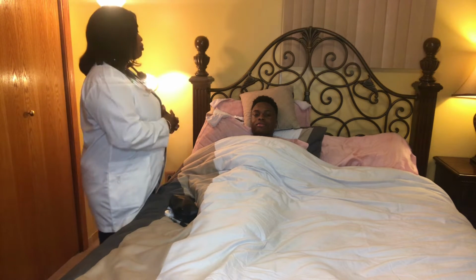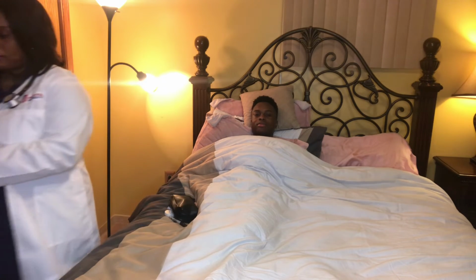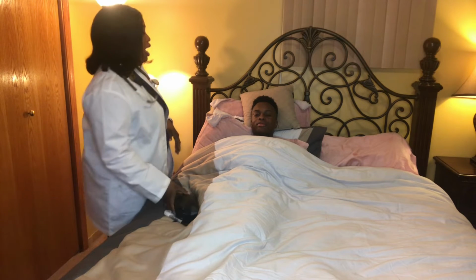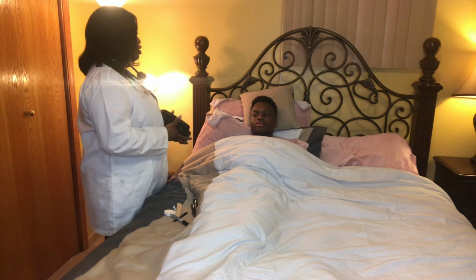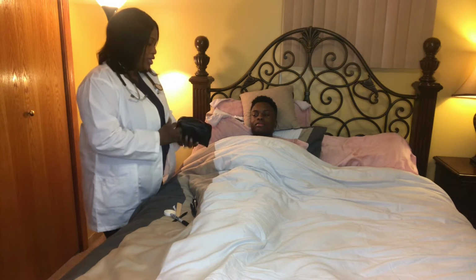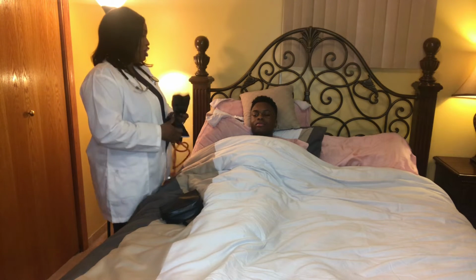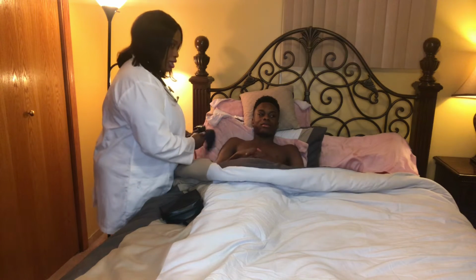First, before I start, I'm going to wash my hands, okay? My hands are washed, and the first thing I'm going to do is check your blood pressure in the supine position. Supine position means that you are lying down in bed. So I'll be checking your blood pressure on both arms, and also sitting up, during this assessment.